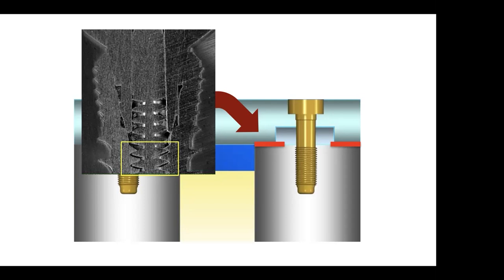You lose the friction or the preload between the threads, and the screw will rotate counterclockwise, which we call screw loosening. So when the external force is applied, it'll press the frame down, reducing the tension inside the screw or making the screw lose its preload, and that also makes the screw lose its friction, and then that's how the screw loosening starts.